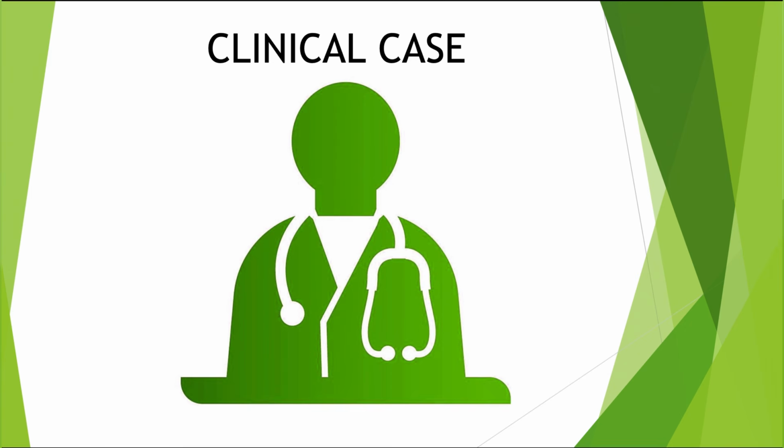So today's clinical case actually isn't really a case at all. I was in the middle of making a video for a urology training that's coming out soon, and as part of it, I was doing some practice. These are practice moments where I guide you step by step and do the exam at the same time as you.